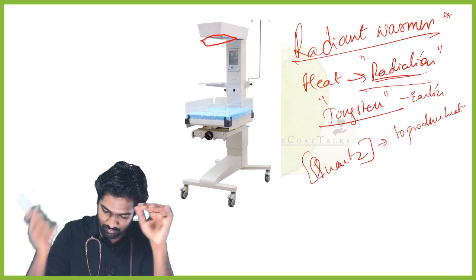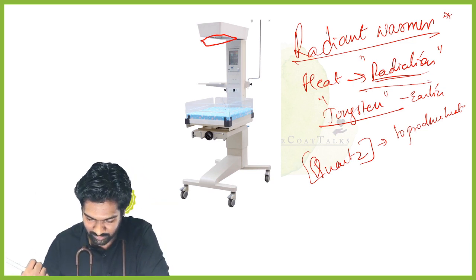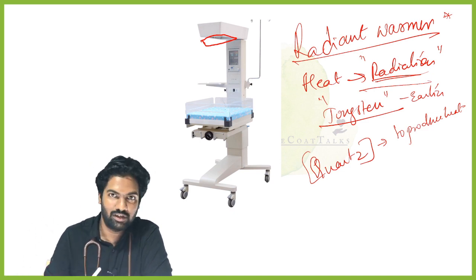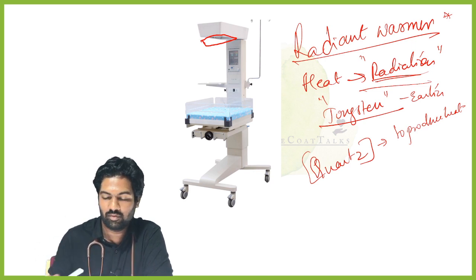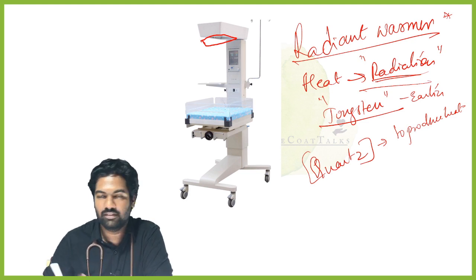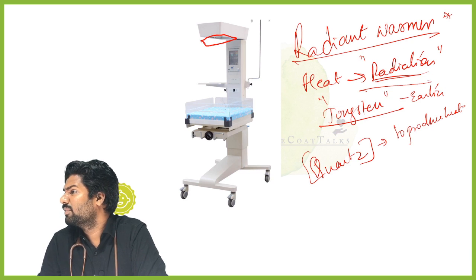Okay, fine. Regarding the radiant warmer, the questions they might ask pertain to the temperature of the newborn. What is a thermoneutral environment? What is the normal temperature at which you want the baby to be kept, or how can this be used in hypothermia? These are the questions which they can ask. Any questions which you have got?